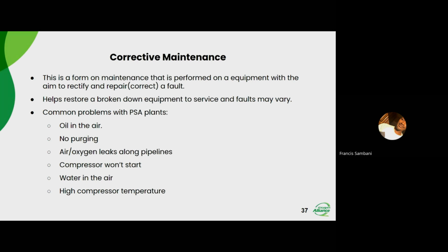And then if your compressor won't start, that might point to something upstream, or it might be the compressor itself. Upstream is where the compressor gets its power from. Maybe someone was working on something and changed the phases, something like that. Or maybe your motor overload switch tripped, which monitors the current going to your compressor. So that might be why your compressor won't start. But it might also not start because of over temperature. That's another problem on its own, so we'll go to that one when we get there.